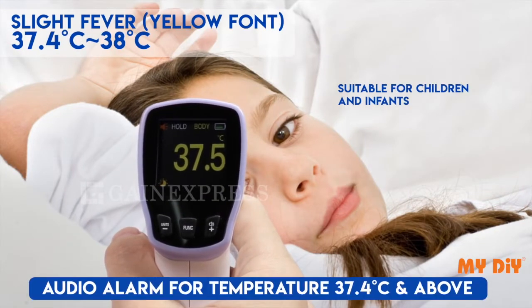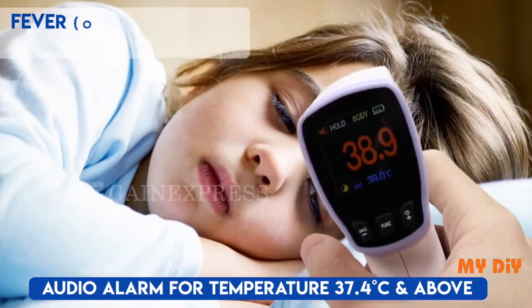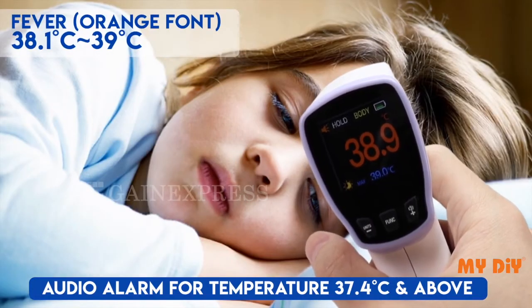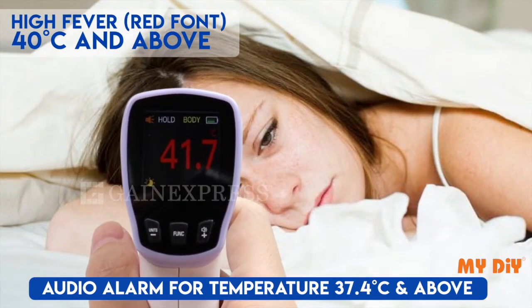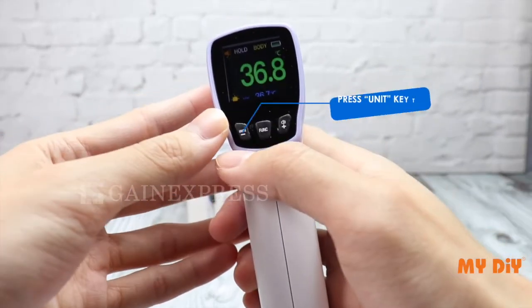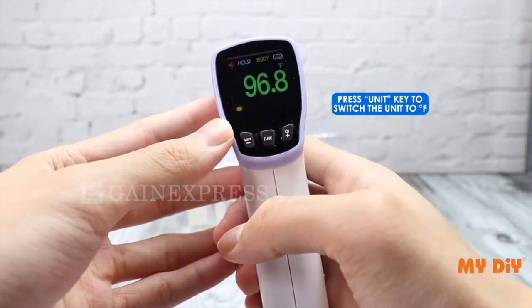For slight fever, the font becomes yellow and an alarm will be heard. Orange font will be seen if the temperature is between 38.1 to 39 degrees Celsius. Red font is for high fever. To switch the unit to Fahrenheit or Celsius, press the unit key.